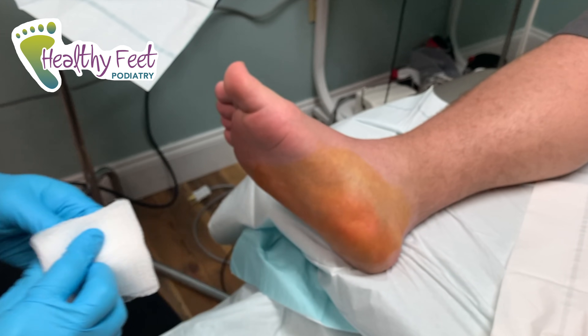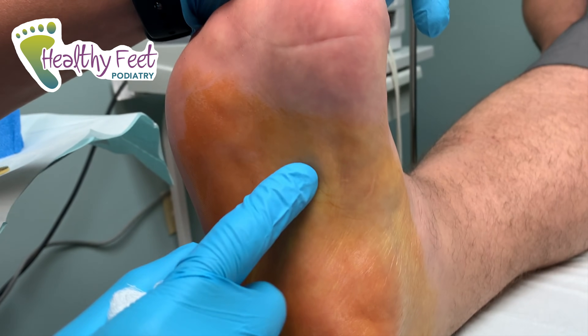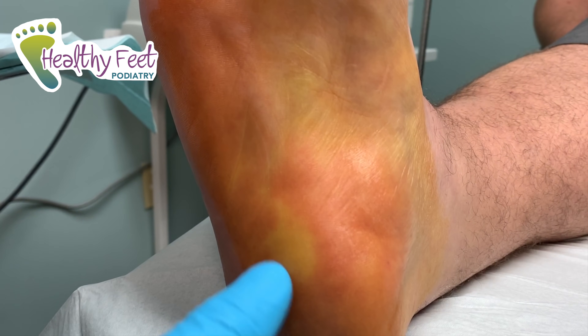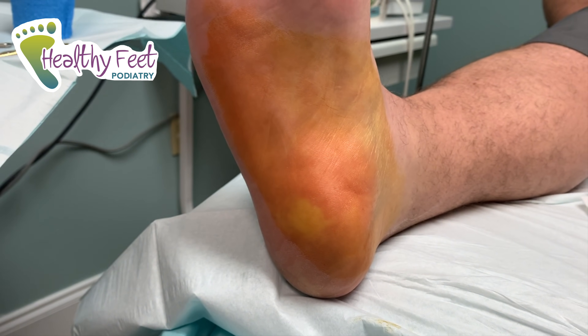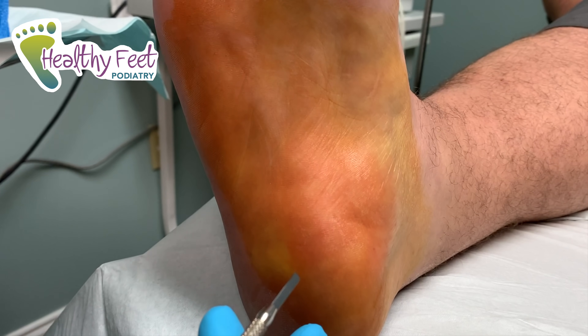We've got our patient nicely numbed up. If you see when I pull his foot back, you can really see the tension of the plantar fascia right here — it attaches all the way back here. We're going to release it right around this area.